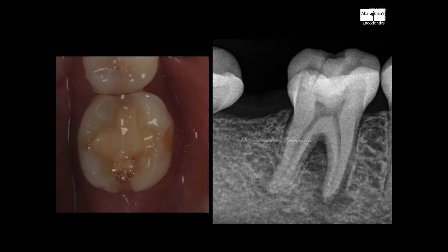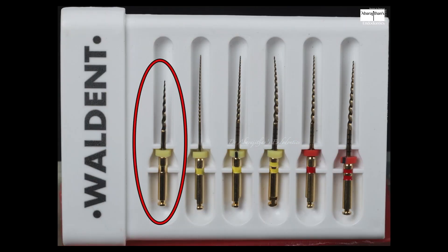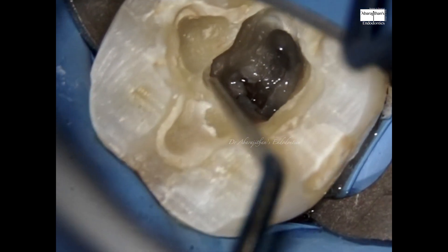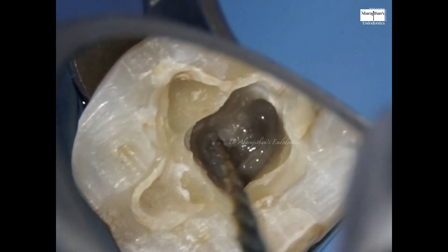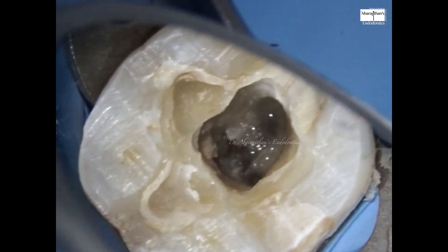This is situation number one — a mandibular molar with a lesion and a crack that did not extend to the pulp chamber, so it could still be saved with root canal. In this demonstration I did not use any hand files, as that would be the best way to evaluate the efficiency of the file. I located the canal orifice with the DG16, following which the orifice shaper is used first in the mesio-lingual canal — you can immediately see the pus discharge from the canal.